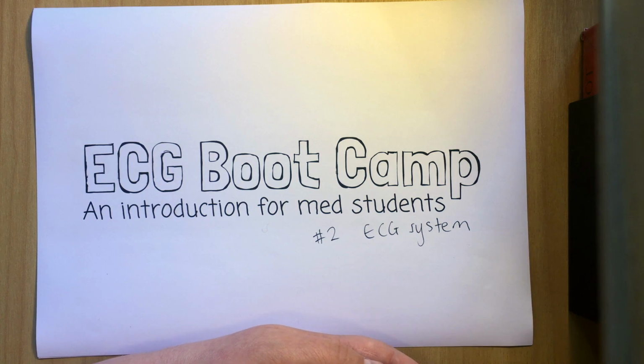And I guess a thing to talk about before we get started is why have a system? Often when you're in the hospital interpreting, say, an ECG or an X-ray of some kind, people more senior in the hierarchy will say, do you have a system for that? And what we really encourage is to develop a way that you do pretty much everything you do within medicine, so that you can do it the same way every time and you know that there's nothing you're missing. So why have a system for interpreting ECG?